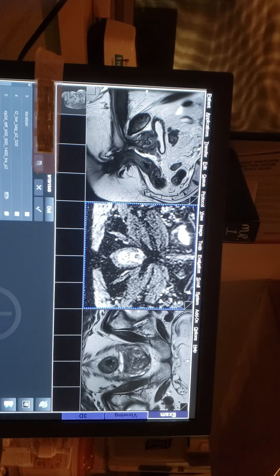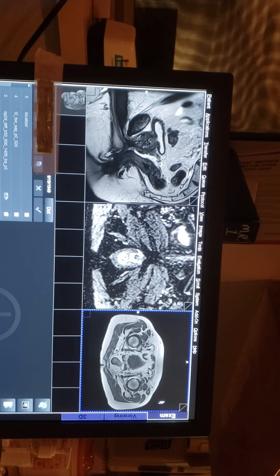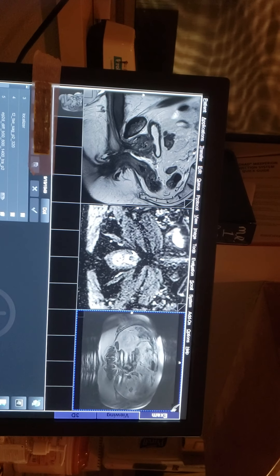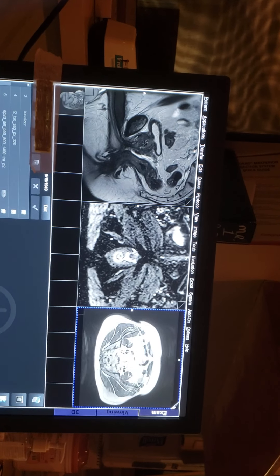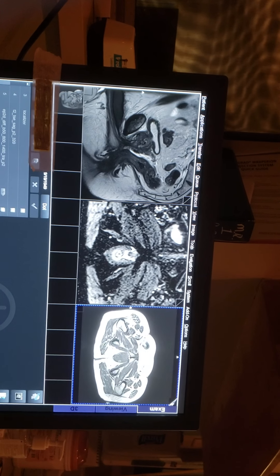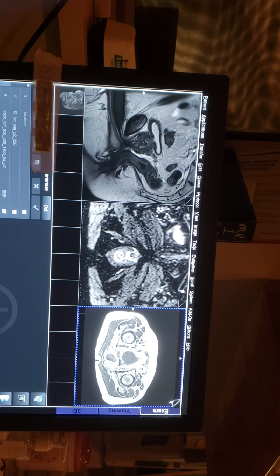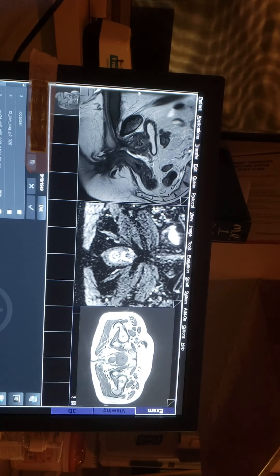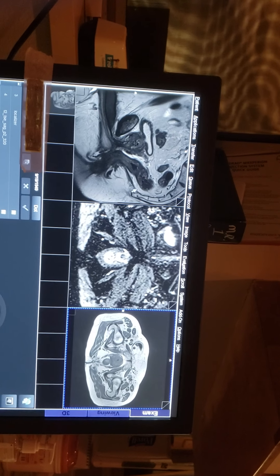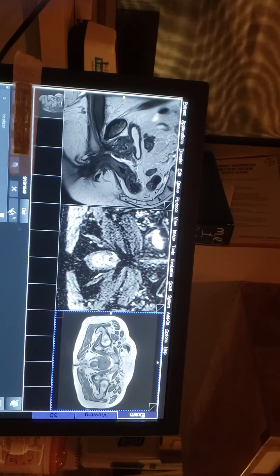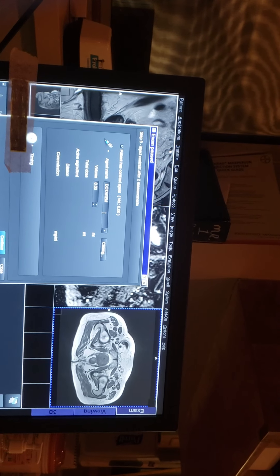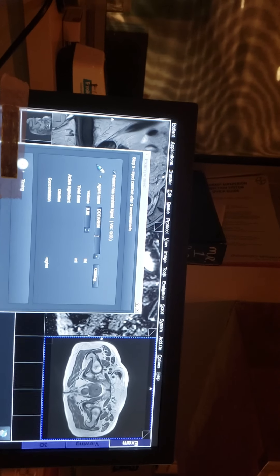Now we do a full pelvis, so this is the full pelvis running. This patient is already diagnosed with cancer, so this is the exam they were looking for. We do dynamic, and the only time we do dynamic is when the patient is positive.